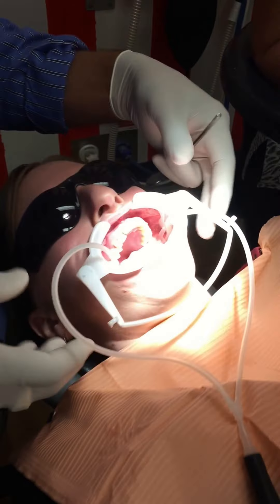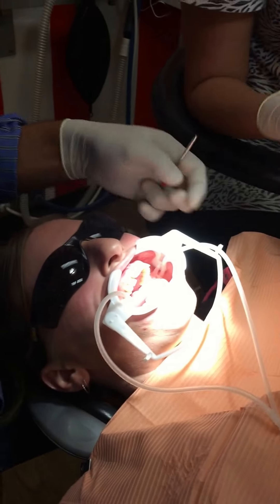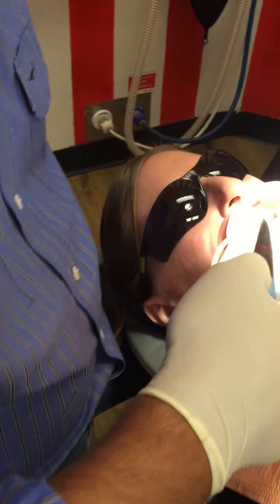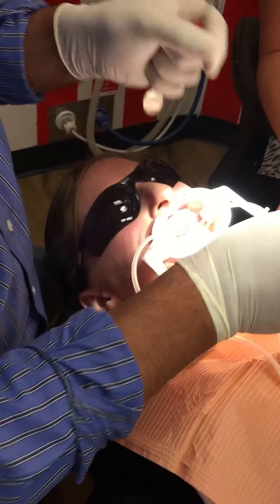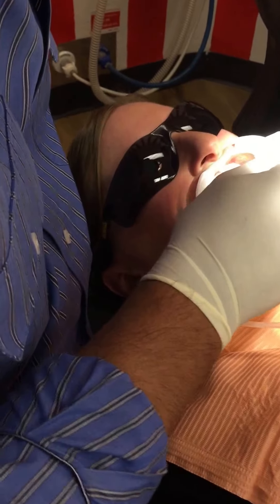It's a little bit tricky getting it on if you're doing it for the first time, but after a while it becomes quite easy. That's it there. Okay so that's all adjusted up nicely. We've got good isolation there, and next thing I do is I just do one arch at a time.